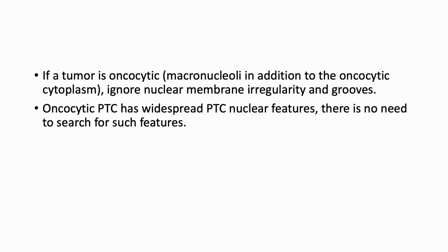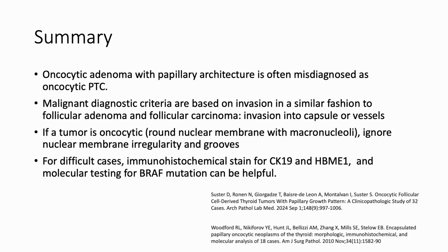Oncocytic PTC shows widespread PTC nuclear features. There is no need to hunt for them. If you find yourself unsure whether the nuclei qualify as PTC nuclei, the tumor is almost certainly not PTC. Conclusion: oncocytic adenoma with papillary architecture is frequently misdiagnosed as oncocytic PTC. For oncocytic tumors, malignancy is defined by invasion, not by papillary growth or scattered nuclear abnormalities.